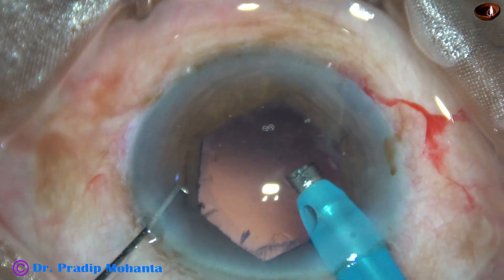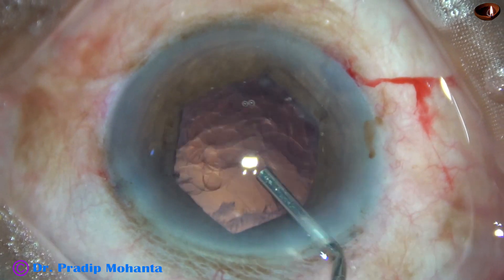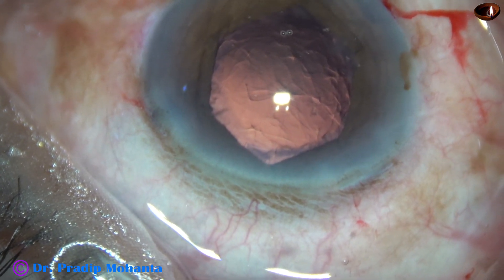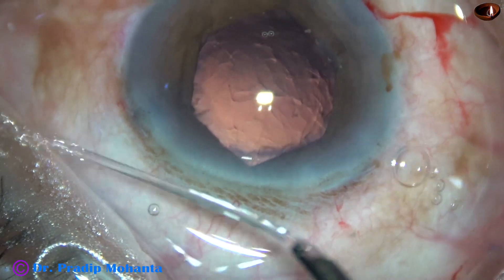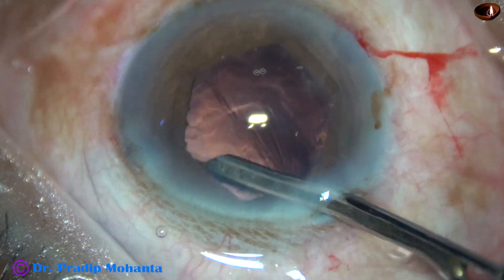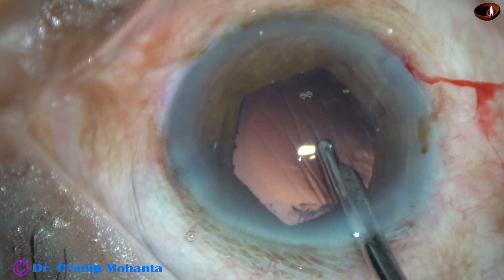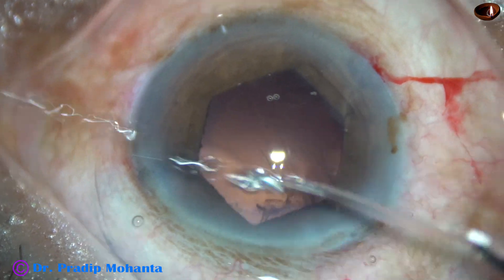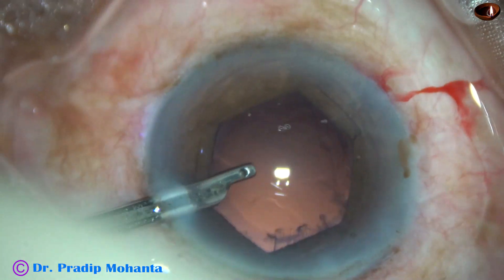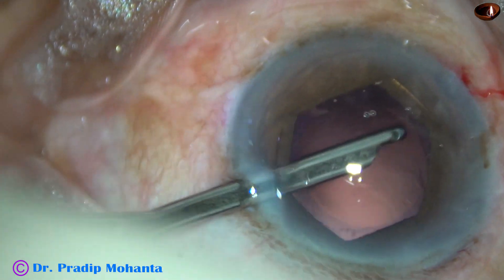The nucleus and epinucleus have been managed. Visco is injected, and cortical cleanup was done with a 23G Simcoe cannula in this case. The sub-incisional cortex is removed going through the left side port. The right side port was too small.